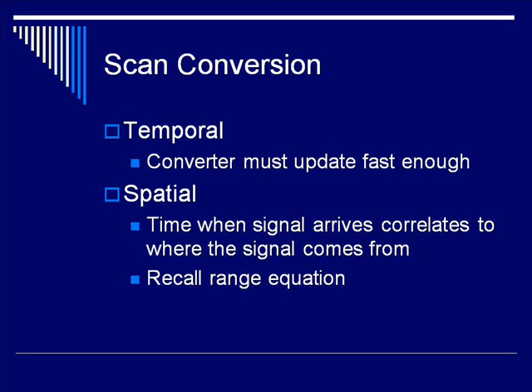In our speedometer example earlier, a speedometer that only updates every 2 minutes isn't going to give you a great idea of how fast you're going at any given point in time. Similarly, for our ultrasound image, we need to update fast enough that we get a coherent image. Usually, we describe this in terms of frame rate.